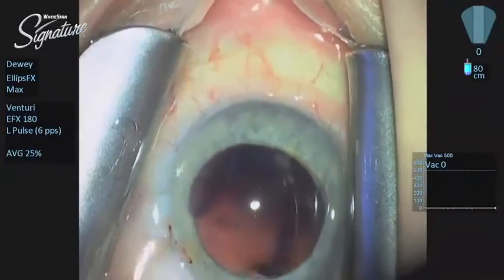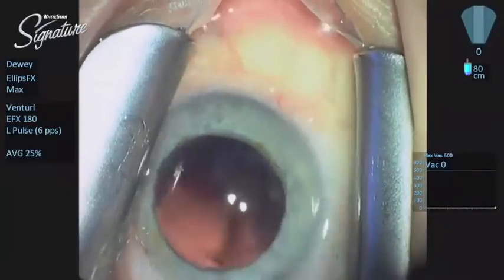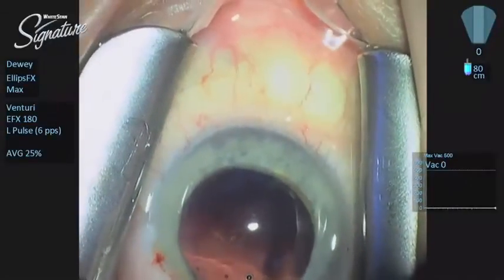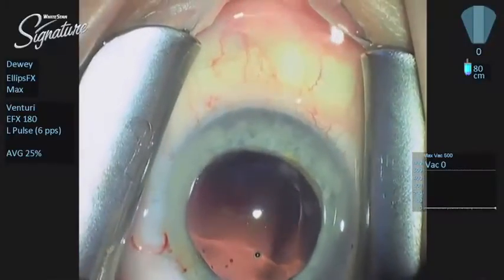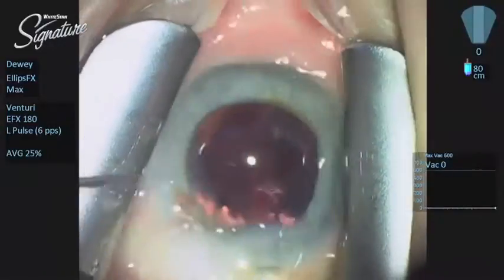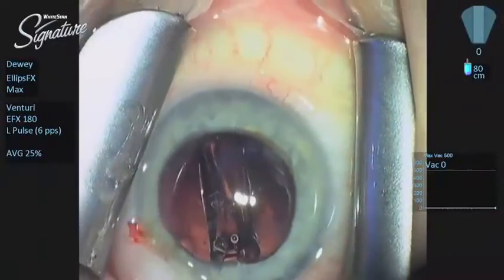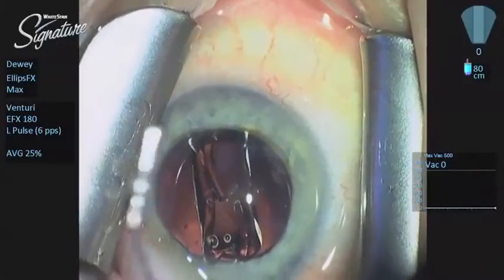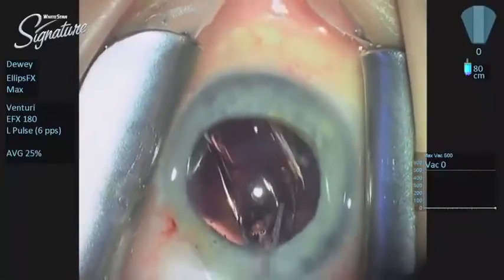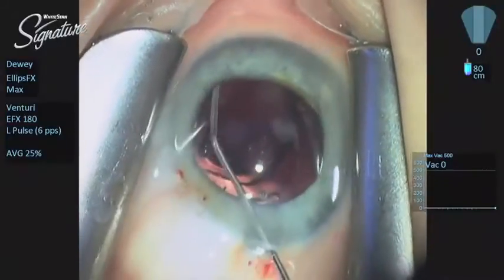We are going to put a good cohesive viscoelastic — Healon — into the posterior capsule and inflate it pretty well. All I am trying to do is create space for the placement of the single-piece Tecnis lens. Here is a little Endocoat. I love this step because as soon as you open the incision, a cohesive viscoelastic has the tendency to come out of the incision, whereas the dispersive plugs that incision. As I engage the incision with the tip of the injector cartridge, there really isn't any efflux of viscoelastic out of the eye. I get the leading edge into the bag and then help it unfold by gently nudging the haptics out into the fornices of the capsule.